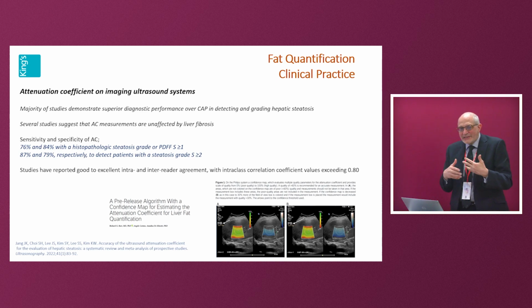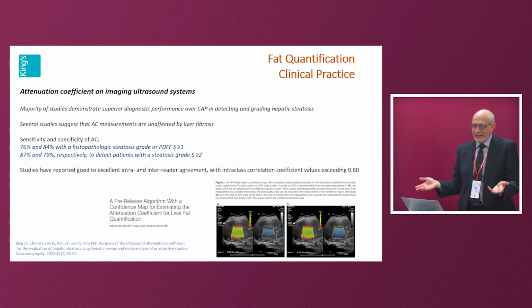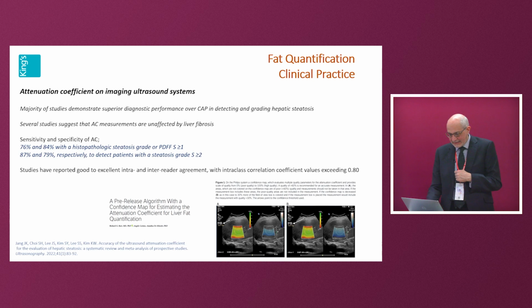And there's no consensus yet on the number of measurements you take. In fibrosis, we took 10 because, why? FibroScan did 10, so everyone did 10. We produced a paper published in Radiology that said you only need 6, and it's accurate. So now you go down to 5 or even 3 with 2D elastography. How many do you need in fat? Who knows? Certainly not 10, but certainly less than that.